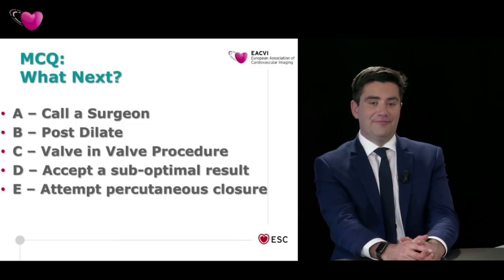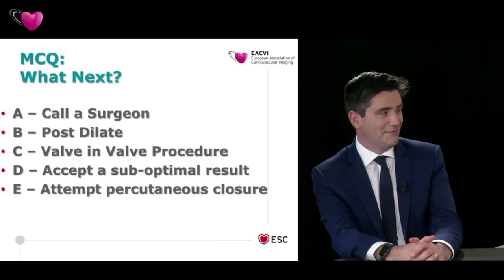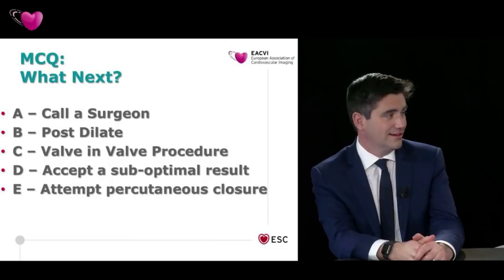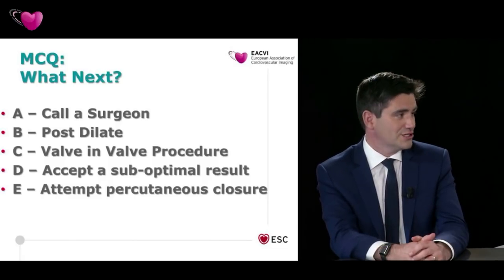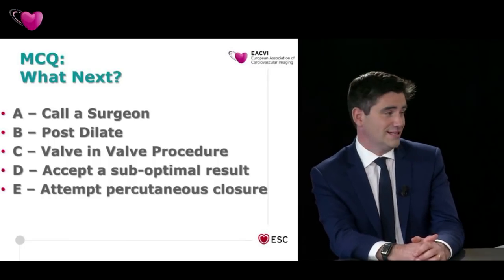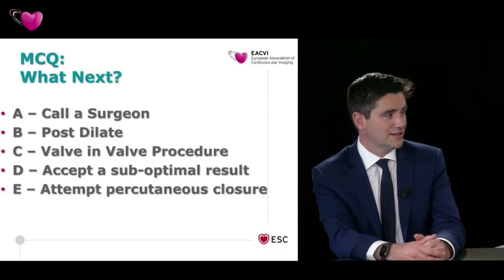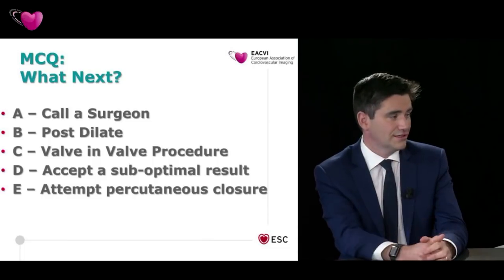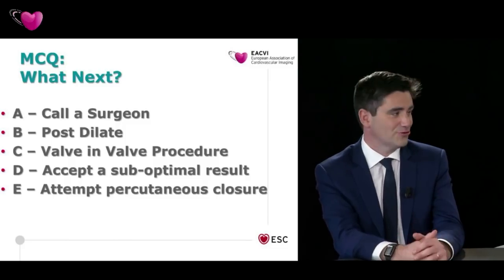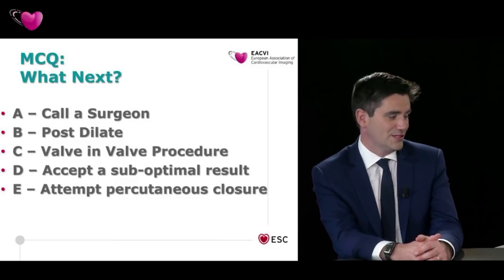Well, I think, as you say, it's difficult. The chances of getting lucky third time round and deploying the valve seem small. And I think you're likely to burst the balloon again, with the potential for stroke and complications associated with that. So I think we've had 2 goes. That's probably enough. I think the percutaneous closure is quite attractive. Whether we think about doing that now after a long procedure, that's something to think about, but it's certainly an option down the line. I don't think we're going to call a surgeon. The patient has already been turned down for surgery, so yeah, I think I'm leaning towards E. We'll see what the audience think.